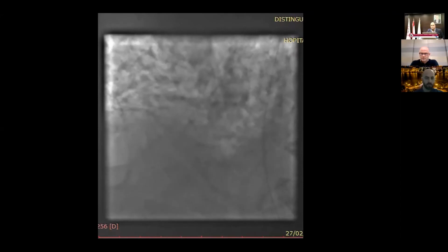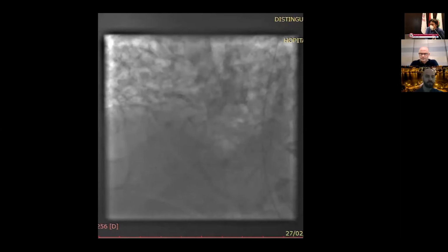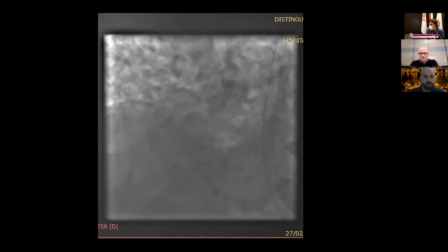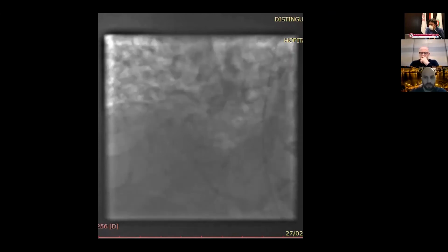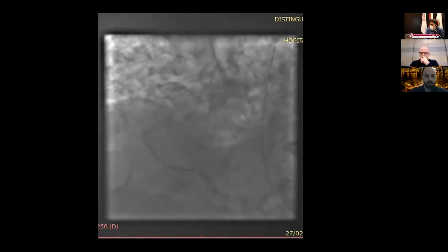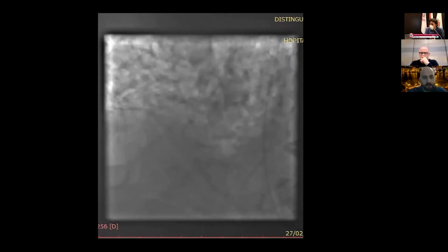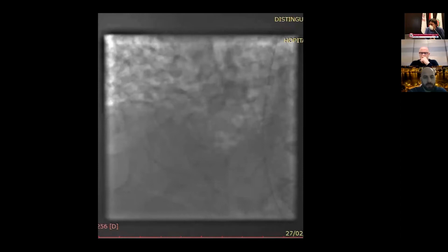Dr. Edis, what do you think at this stage? Because we have a cardiogenic shock, we stent the culprit lesion, and here we are trying to treat another lesion on the RCA. In our daily practice, we have complications like this. We don't need it, but it happens. It's a very calcified lesion that is not dilated by any balloon. We need to change the guiding, and we don't know if we have induced any dissection.